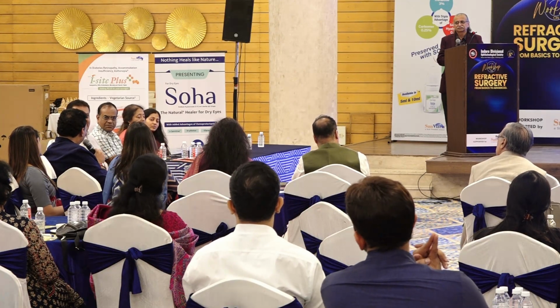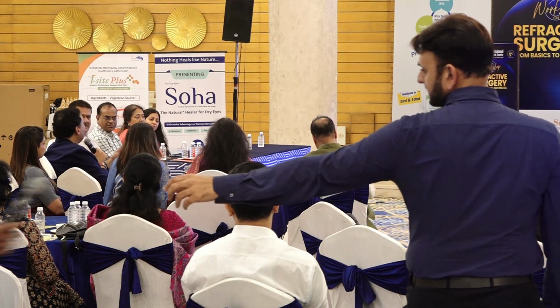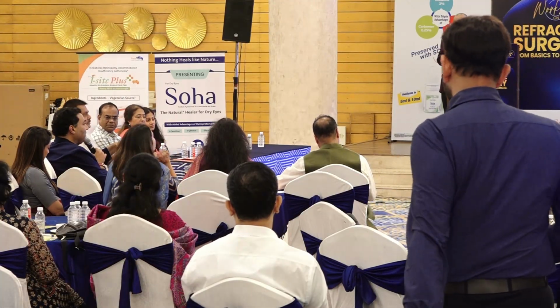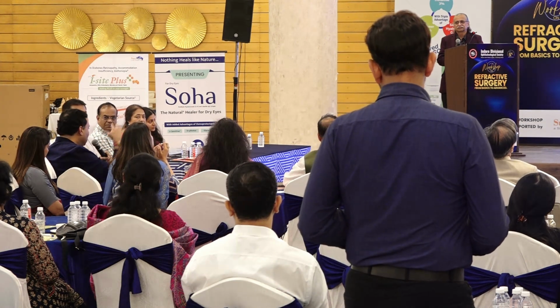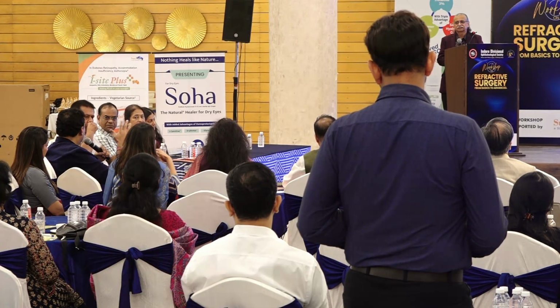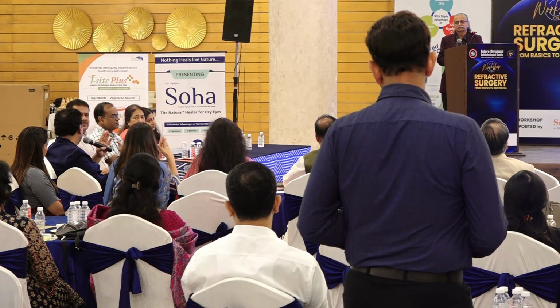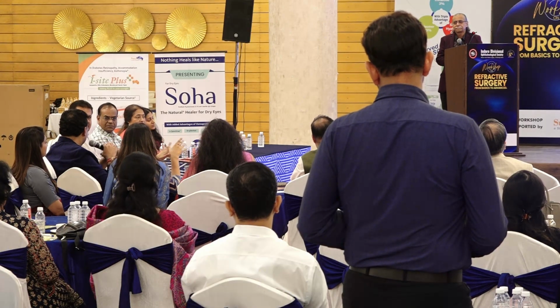You are not taking care of lenticular aberrations. Lenticular aberration changes with age. For example, what is at 25 would change at 35, and what is at 45 would change. So one good thing about what he said about the Wavelight Plus is that it takes into account the lens tilt and the lens accommodation, and it does a complete model of it, which is not something we see in conventional procedures.